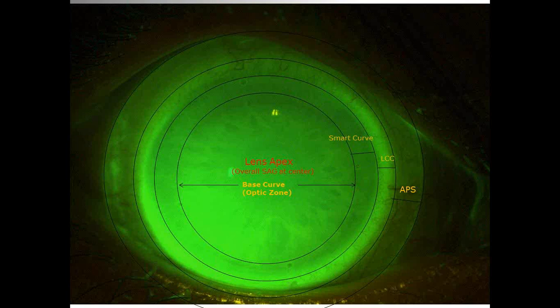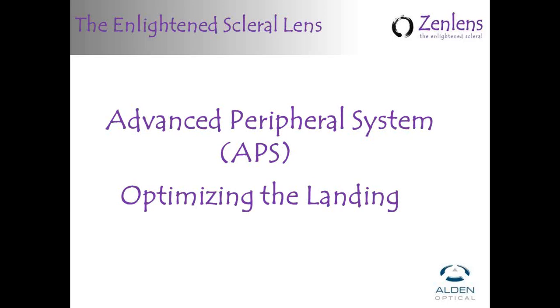Yeah, that's a great point, because I've seen pictures that have been sent where in a head-on shot like this, it looks like you have touch, and then they submit an OCT scan that shows that there actually is clearance. It's just less clearance than what is around it, and so that's that fluorescein thin. Sometimes it looks like touch. So the Wratten filter, very good idea.